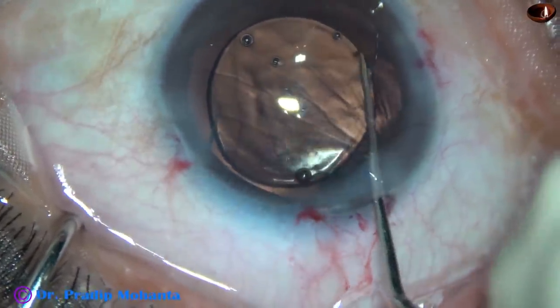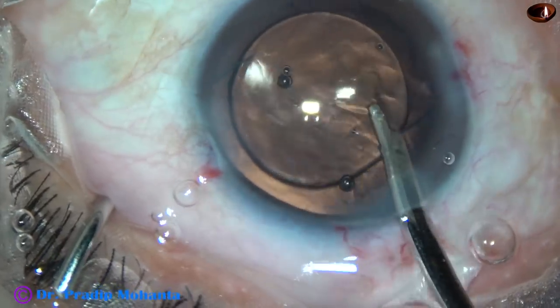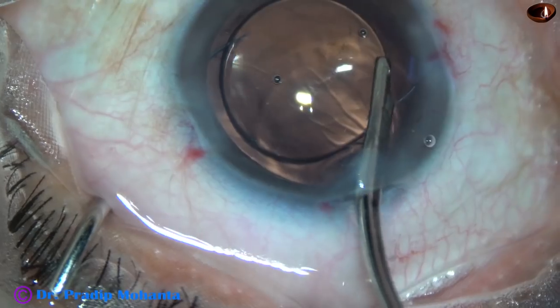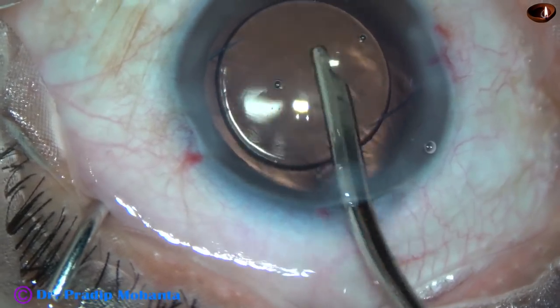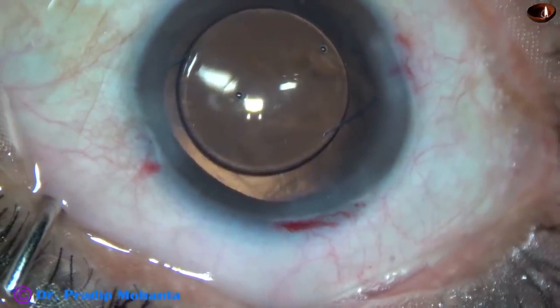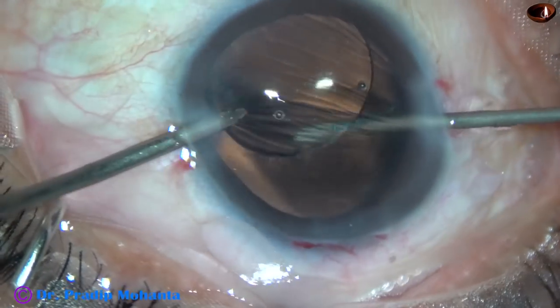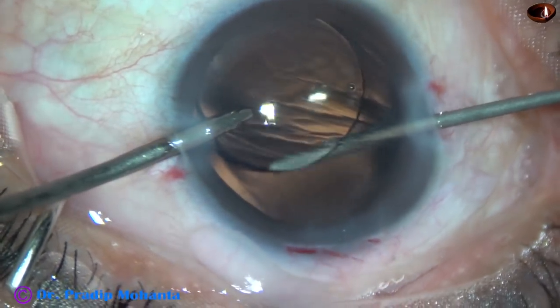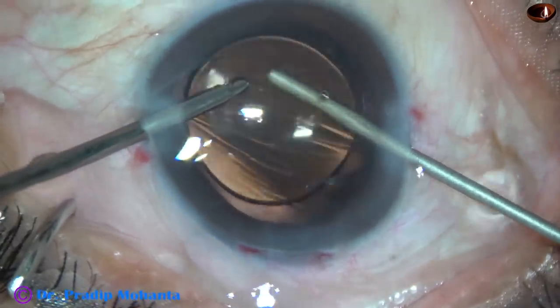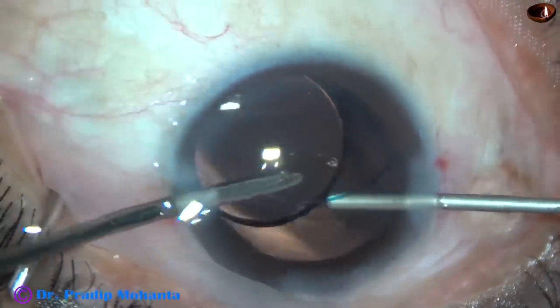But I do not use the Simcoe to remove the viscoelastic from behind the lens. So what I do — I use the cutter again, go through the side ports, and remove the viscoelastic by cutting and aspirating. Not just aspirating and cutting — first cut and aspirate. And thus I remove all the viscoelastic from the anterior vitreous and from behind the lens.